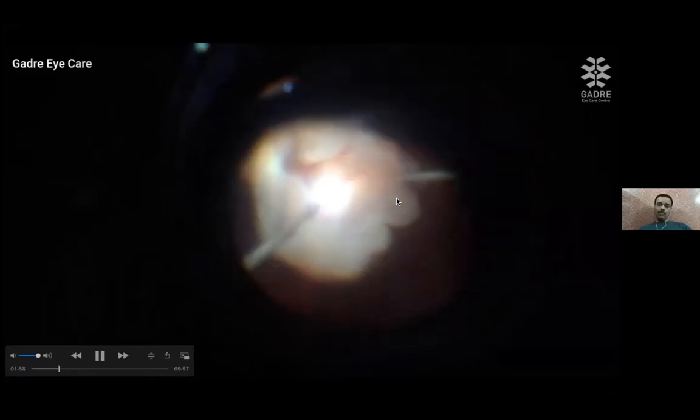Now, with the light pipe in one hand and the forceps in the other, I'm trying to tease out the immature membranes and the condensed vitreous, hoping to go more posteriorly, open the funnel and reach the disc. I shifted to a bimanual approach, using forceps in both hands, trying to tease away the membranes and open that rosebud. Gradually, the anterior funnel was opened. Some semblance of a disc was seen, teasing out membranes further. You can see the funnel is starting to open gradually.